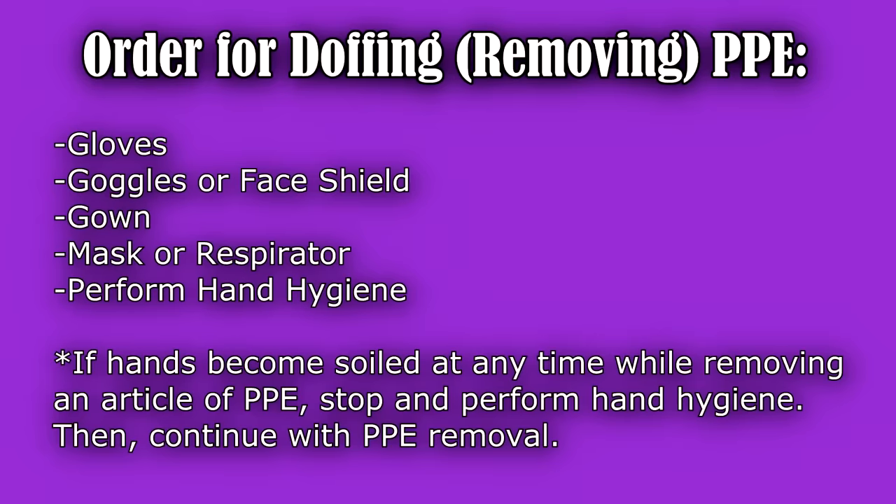Now let me show you how to doff or remove your PPE. The sequence for removing it will be: gloves first, then goggles or your face shield, then gown, and then the mask or respirator, and then wash your hands.